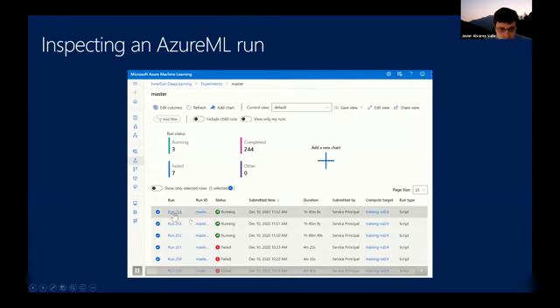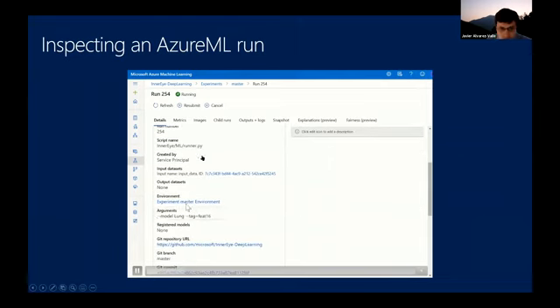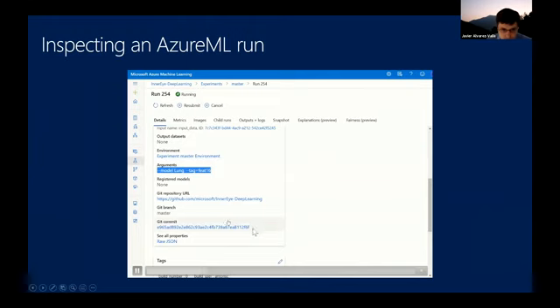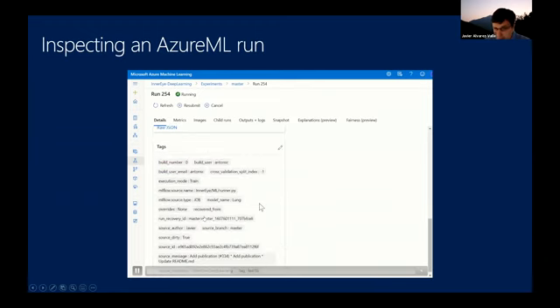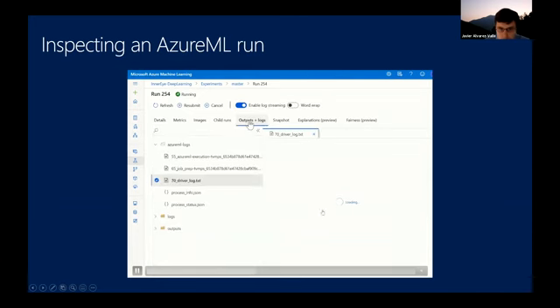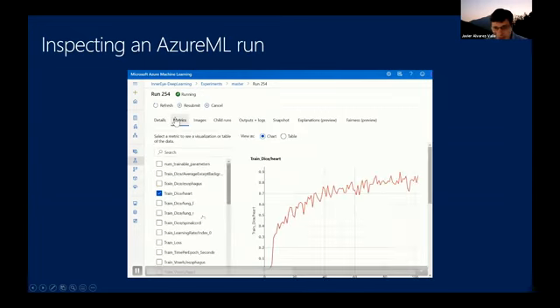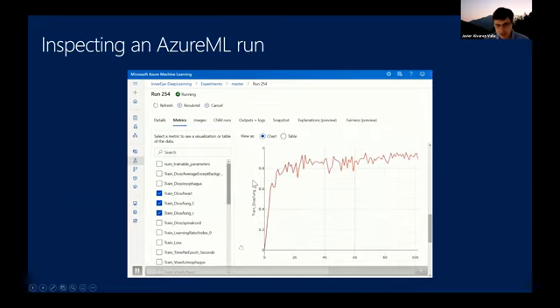Then once you submit the experiment, you can go to the dashboard, keep track of all the experiments, see what arguments were used to train that model, look at the Git commit that was the last one to submit that job. You can look at the logs that the training of that machine learning model is producing. You can look at the metrics, so you can see, okay, what are the dice score on the training set for these different structures, and you will see plots.